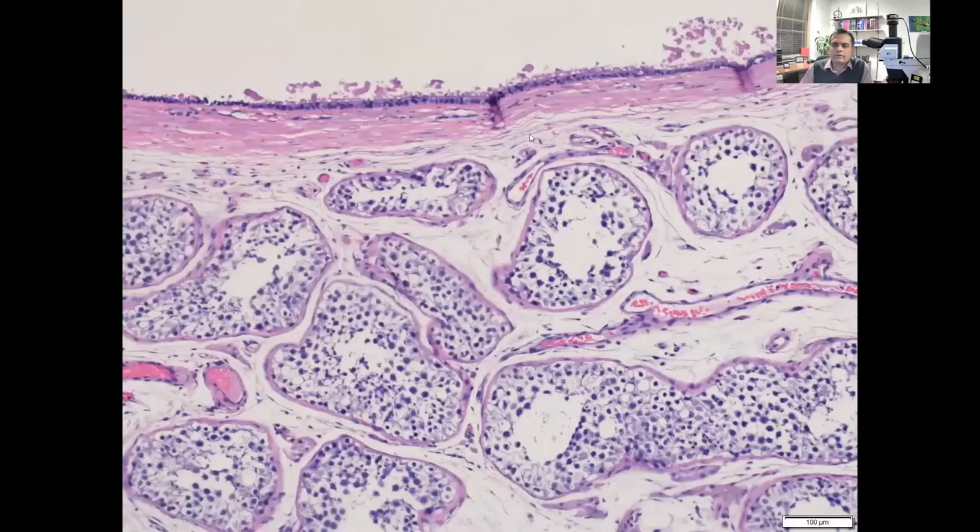So if you look closer, again, you can see clearly what I was mentioning as ciliated columnar epithelium with some secretions, which looks almost like respiratory lining or tubal lining or something like that. And then again, the seminiferous tubules, I do not see any evidence of GCNIS, and some of them have clear evidence of spermatogenesis to full maturity.